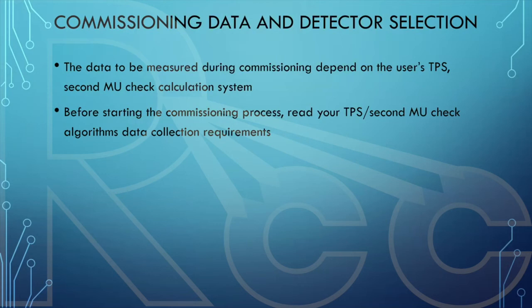You need to know what your second MU calculation program is. The data to be measured during the commissioning is user dependent, meaning that, for example, Eclipse from Varian is going to be different than Pinnacle.